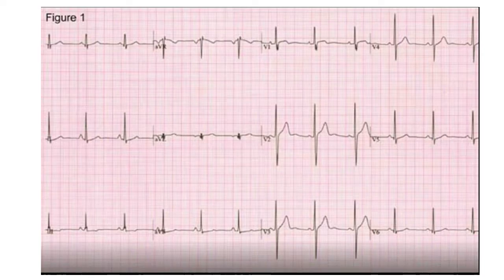So when you look at the full 12 lead ECG, again, remember, sometimes you might see a small dip in lead 1 and even lead 2. Sometimes maybe lead 3, but for the most part, not everyone will have one. V1, V2, and so on, again, some people may have a very subtle drop, but typically it's not until you get into V4 through V5 and V6 where you should see some small Q wave.